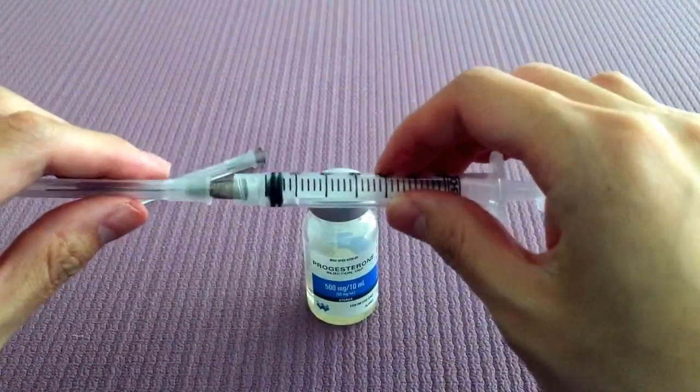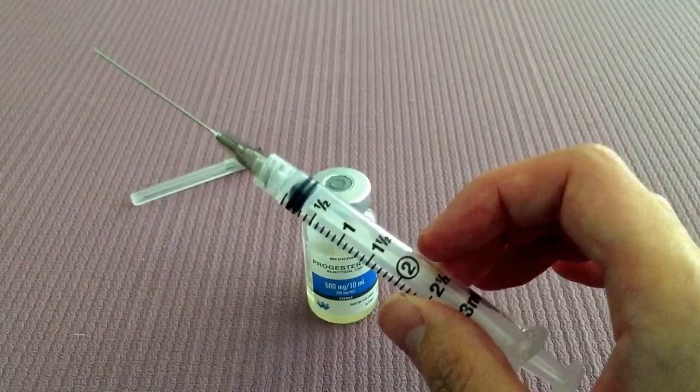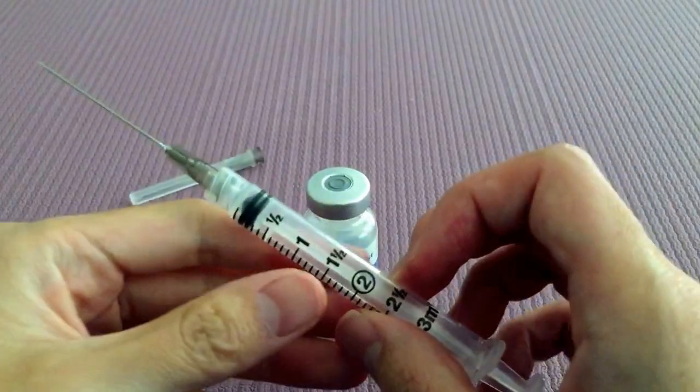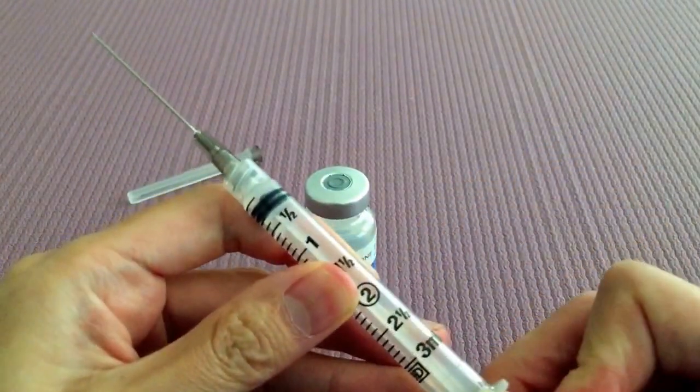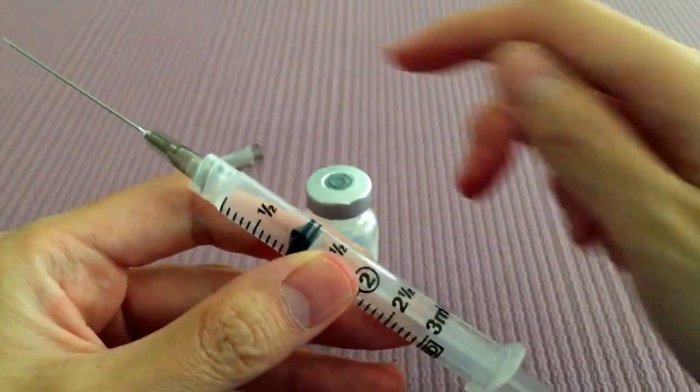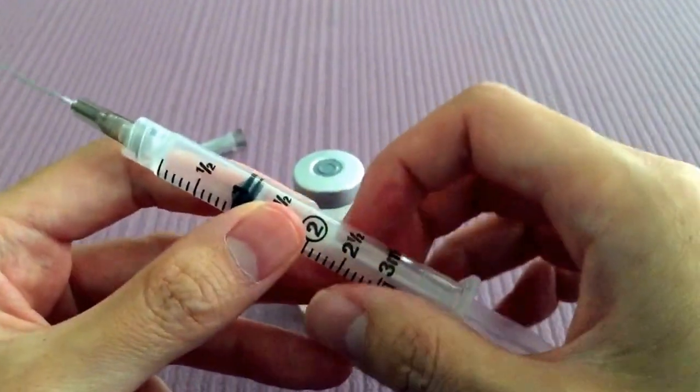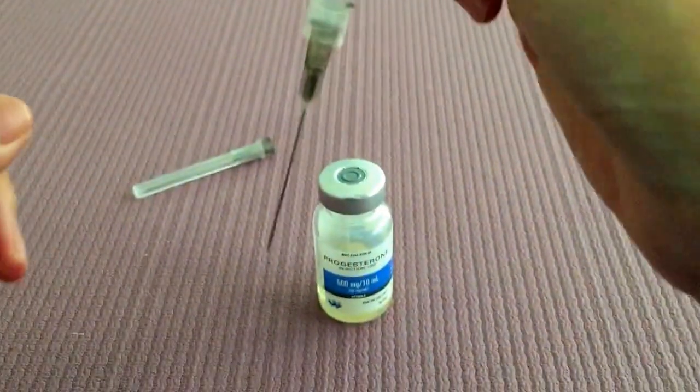So first thing I'm going to do is draw some air. Depending on your dosage, let's just say it's 1 ml, I'm going to draw 1 ml of air. The reason why we do this is because it's highly pressurized inside. You're going to inject the air back into the vial just so that it makes it easier to draw up.